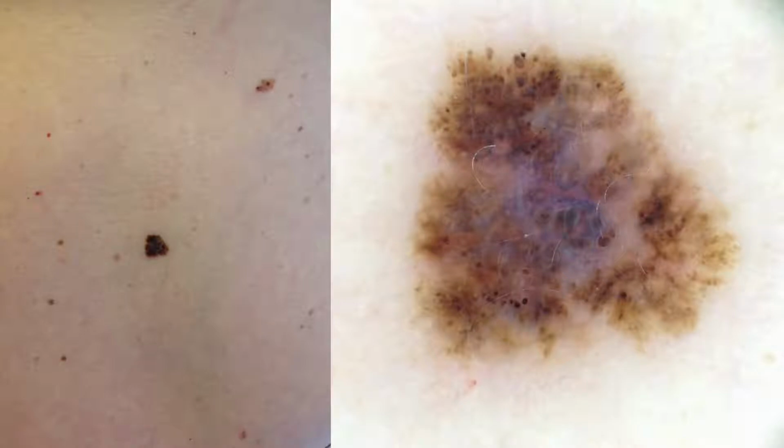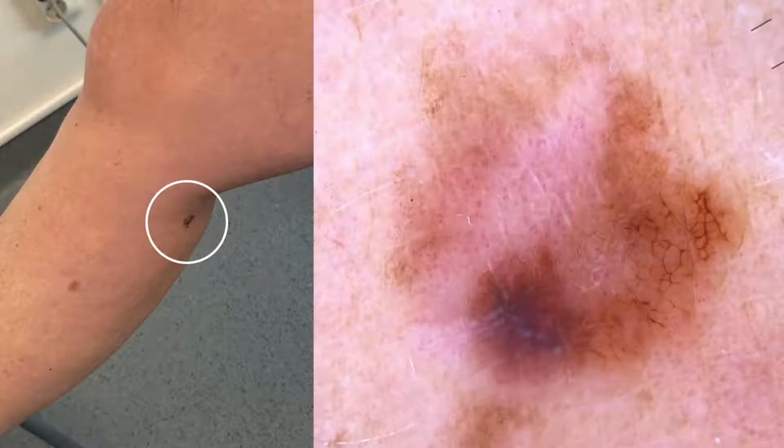So in this example here, we have a lesion with a globular pattern in general, but also blue-white structures that are atypical in the central part of the lesion and also towards 12 o'clock. So atypical blue-white structures indicates invasiveness. In this lesion, we also have some atypical blue-white structures at 6 o'clock, but we also have polymorphous vessels and shiny white lines.